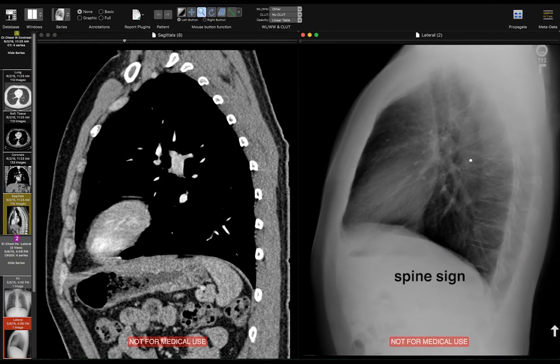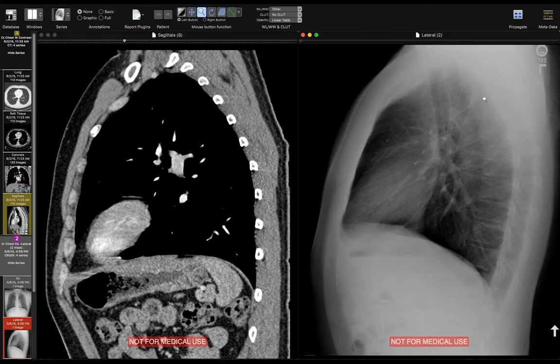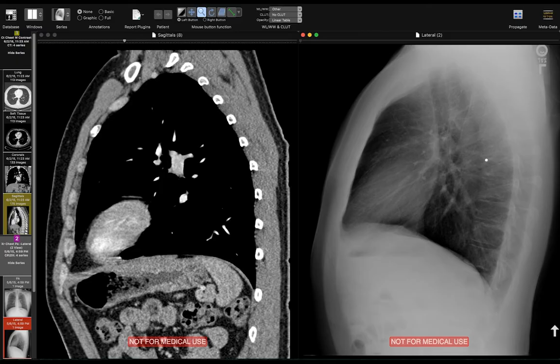Another important sign on the lateral is the spine sign, which is used to detect airspace disease in the lower lobes. In a normal patient, the spine going from top to bottom should become more lucent as you go inferiorly, because higher up there's more soft tissue for the beam to penetrate making it more opaque, while lower down there's more lung making it easier for the beam to penetrate. If you're going down the spine and you see the spine becoming more opaque as you go down rather than more lucent, that's a sign of an abnormality — perhaps a mass, a pleural effusion, or pneumonia — obscuring the spine.